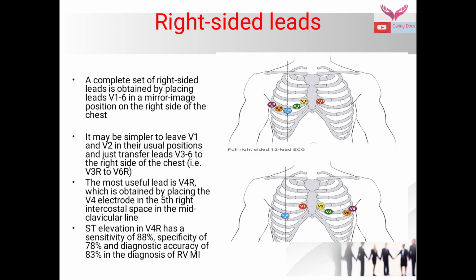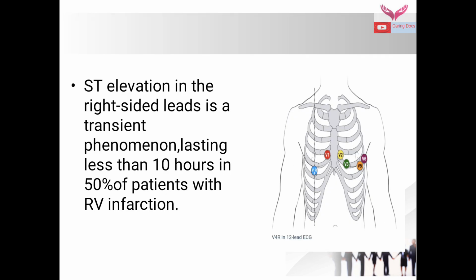The ST elevation in V4R has a sensitivity of 88%, specificity of 78%, and diagnostic accuracy of 83% in diagnosing right ventricular myocardial infarction. The ST elevation in right-sided leads is a transient phenomenon. It lasts less than 10 hours in 50% of the patients with right ventricular infarction.